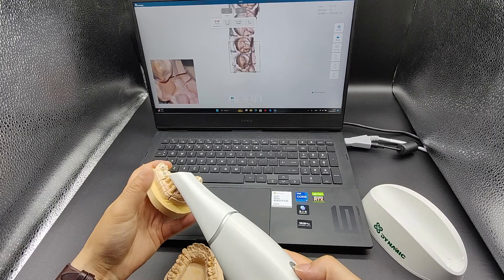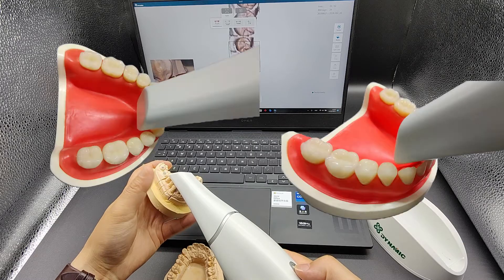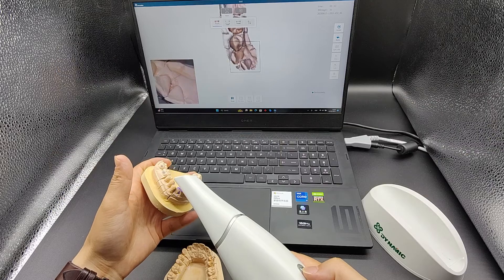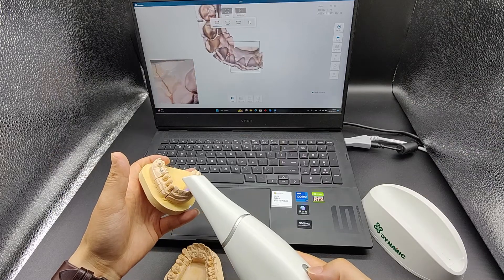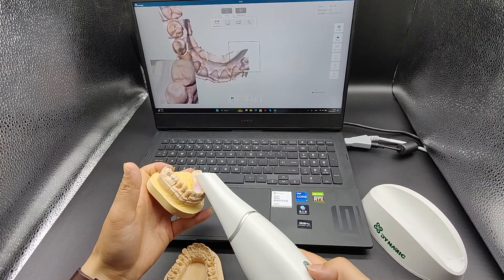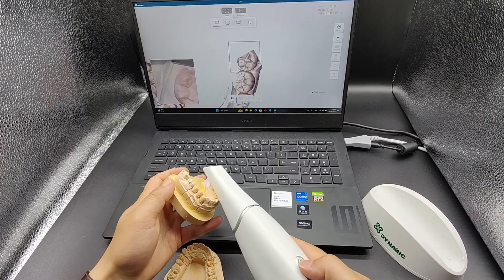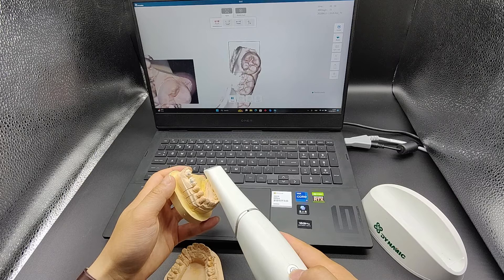When scanning the anterior teeth area, both the incisal and lingual surface should be scanned simultaneously. You can refer to this method. When moving to scan the other side, keep the tip parallel to the teeth as before.